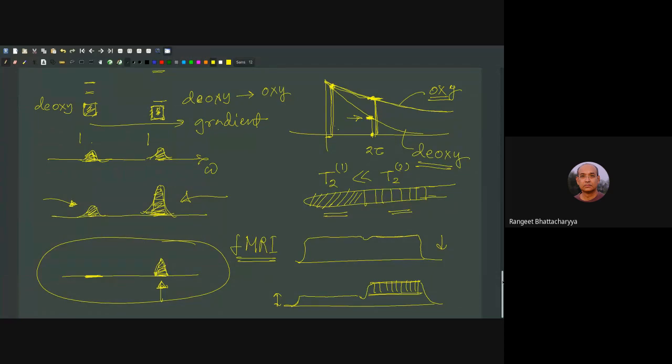Very good. And then you ask the person to engage in some activity. You could play a song and ask the person to focus entirely on the song, or you show some images and ask the person to look at them. Showing images is difficult, because if the person is inside the magnetic field, you can't go in and show pictures. So you fit some non-magnetic contraption.